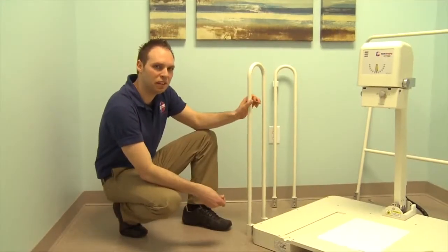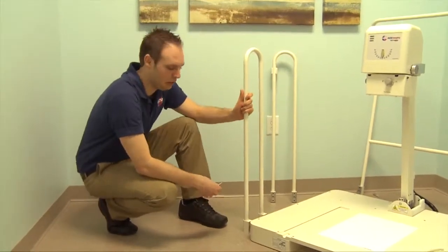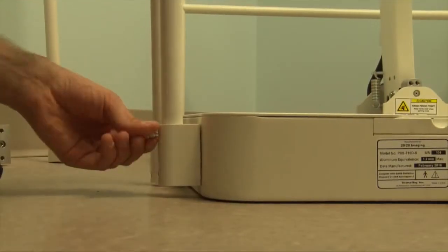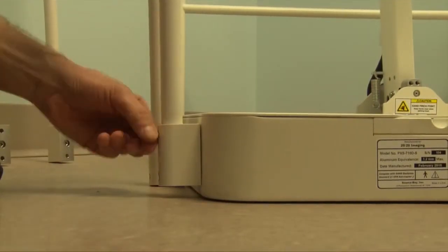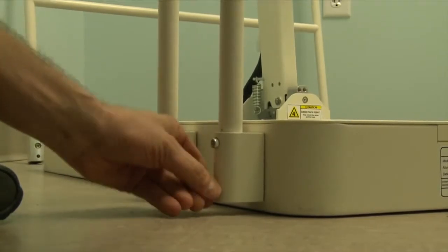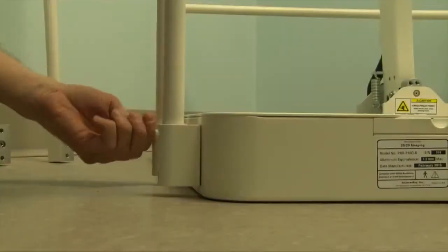We're going to start with installing the handrails to the base with the provided screws. We're going to use a 3/16 hex provided with the system to install. It is recommended to get all of them started first before fully tightening.